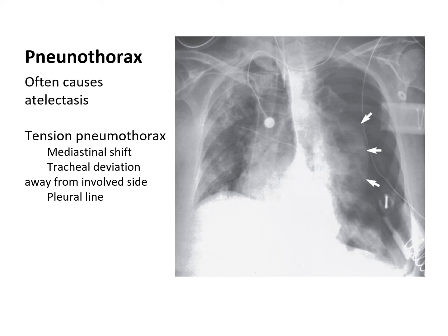So a chest tube has to be placed immediately in these patients because they can decompensate really fast. All that pressure can decrease the venous return and kind of squish the heart and those large vessels, and their blood pressure can drop out pretty fast. So this is considered an emergent situation. You want to get a chest tube in as soon as possible.